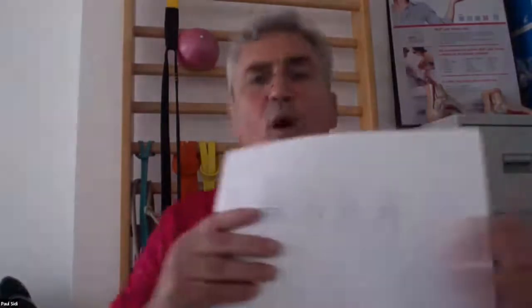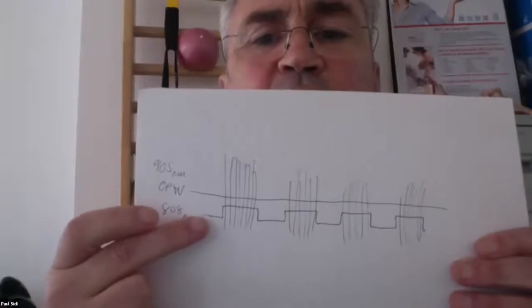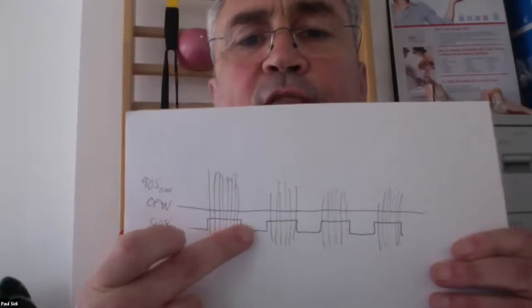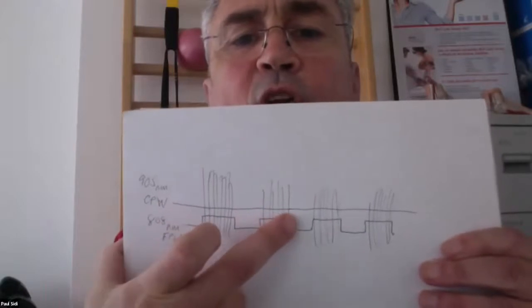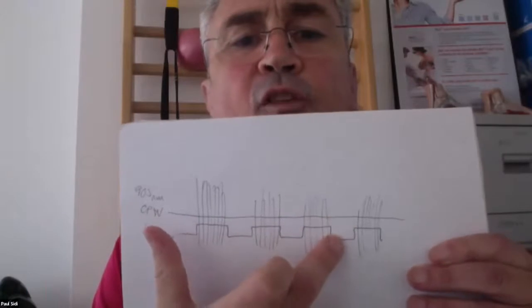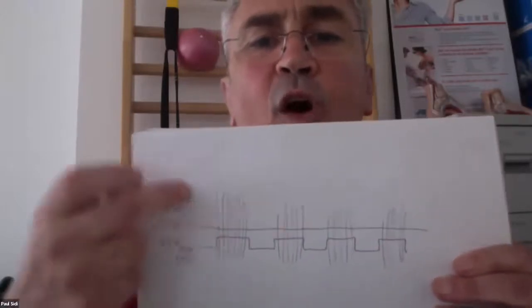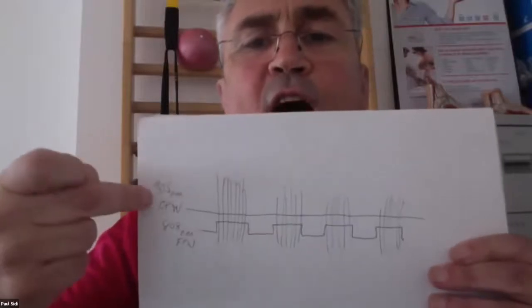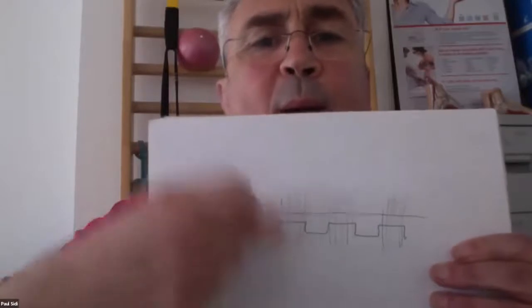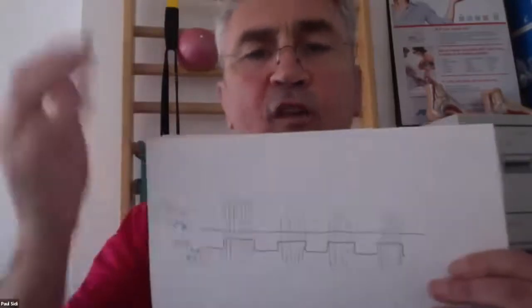If I can show you what I've drawn here, when we've got the 808 with the frequency wave, which is the default setting, it comes on and goes off. Comes on, this all depends on the hertz you've got. Comes on and goes off. Comes on and goes off. What's happening? When it comes on, the 905 nanometers is super pulsar. Bang, bang, bang, bang, bang, then bang, bang, bang, bang, then bang, bang, bang, bang, and so on, like that, for as long as it takes.